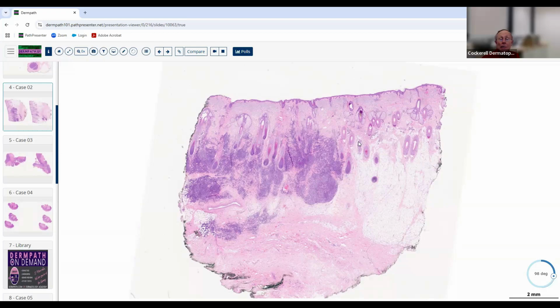Okay, good. Now you pointed out several things at low magnification. That's why I'm not going to high magnification just yet. But notice, first of all, there's no involvement of the epidermis. It's relatively deep, so it's bottom heavy as opposed to top heavy. If this were a pseudolymphoma, you would most likely see inflammation all the way up here, and more of it would be here than here. So this is like a submarine. This is beneath the surface of everything. That's not a good finding when you see that, number one.